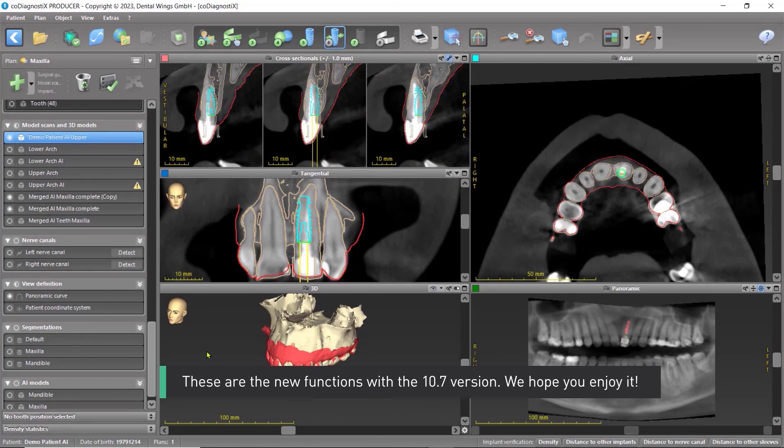These are the new functions with the 10.7 version. We hope you enjoy it.